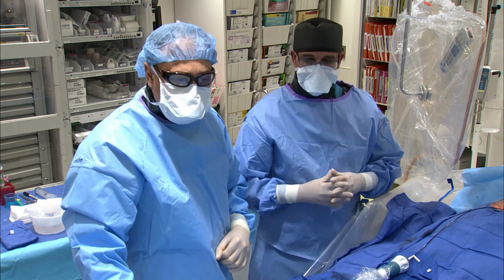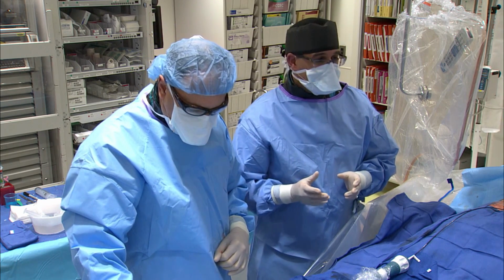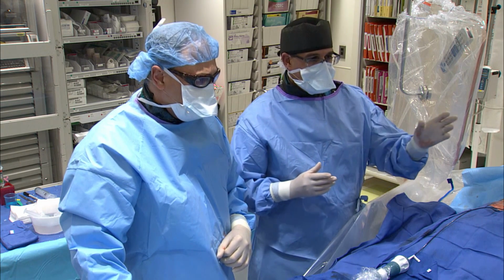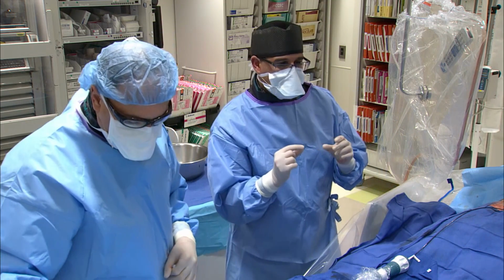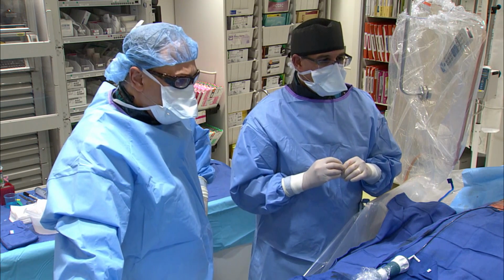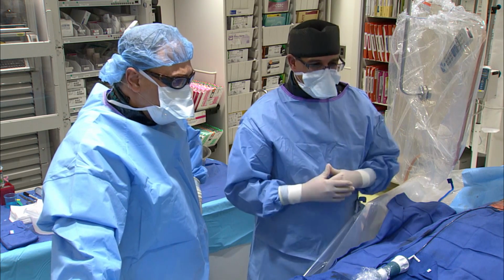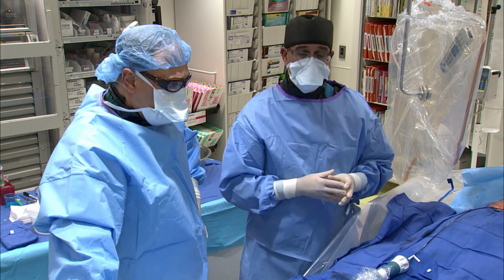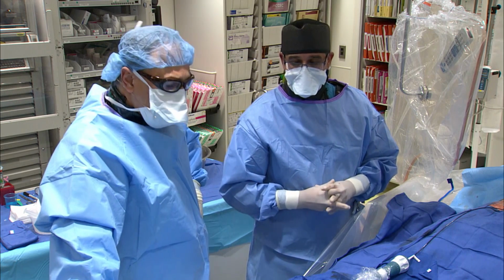So simple ASDs are ASDs that are less than 24 millimeters in size and that have good rims. The more complex ASDs are those that don't have rims. And when we talk about rims, we're talking about areas of tissue on both sides of the ASD, on all sides of the ASD, that will allow you to grip, have the device grip. Other reasons why you might not be able to do this is if the patient has multiple areas, so you might have both posterior and anterior rim deficiencies, or if you have anomalous venous return, then that's obviously a no-no.